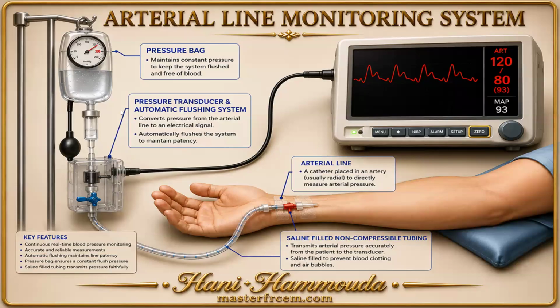Again. So you will turn the three-way to the air. It will be closed to the patient. Then click on zero, press on zero. Then you will return the three-way again as normal. So open to the fluid and to the patient, closed to the air. Clear? Yeah.